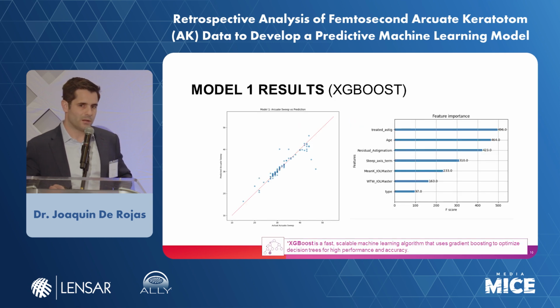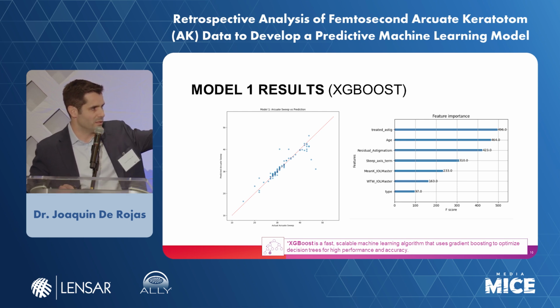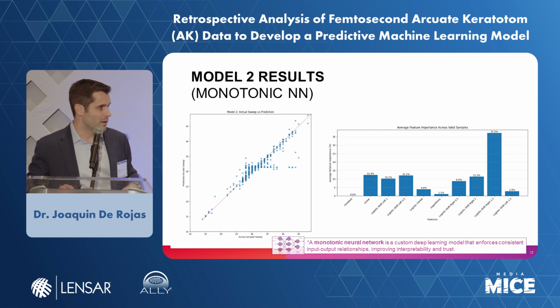So for the first model, we used a gradient boosting algorithm. It's very common for tabular data. And what we found is a really decent model here. You can see the different factors as bars; the longer the bar, the more of an effect it had. Obviously, astigmatism has the biggest effect, and age is second. In this retrospective analysis, we can have pretty good confidence that the arcuate incision was within 2 degrees of what it should have been. So if you got 17-degree paired arcs, could it have been 19? Probably, yeah. It could have been 15. But it has pretty good significance there.